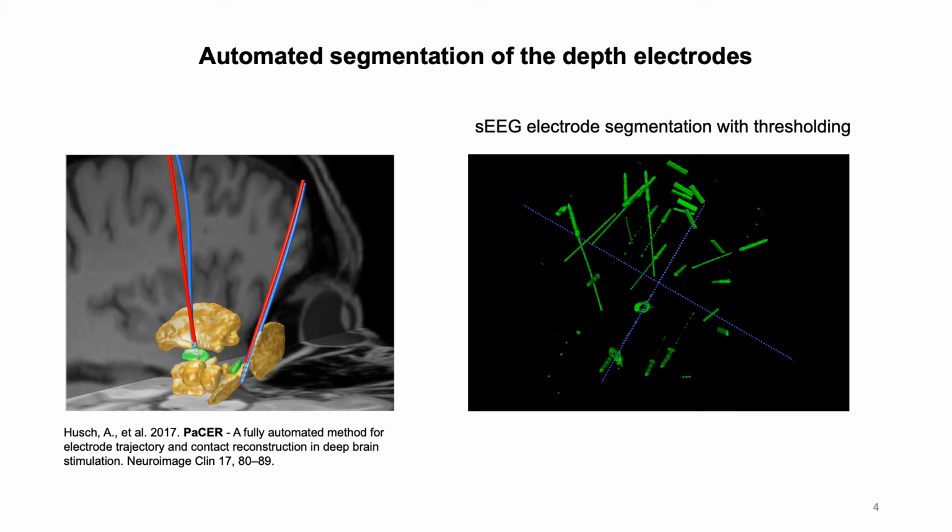Automated and accurate electrode extraction approaches exist for DBS electrodes. However, to our knowledge, there are no available tools for segmentation of SEEG electrodes. But we wanted, by including post-operative DBS scans, to increase dataset size and ensure the network learns a solution that is robust towards all kinds of depth electrodes.